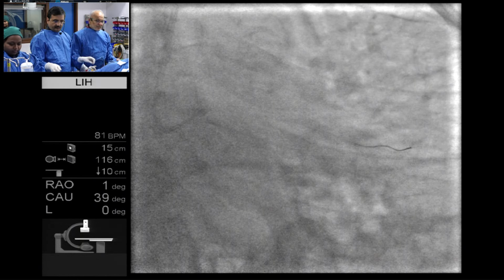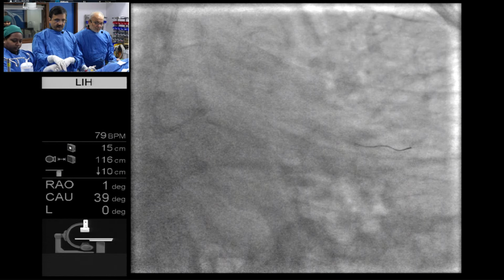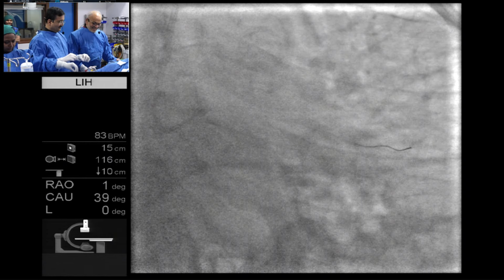OCT. I think most of the post dilatation is done by what I call the oculosphincter reflex. You look at the size and you see your body's reaction.